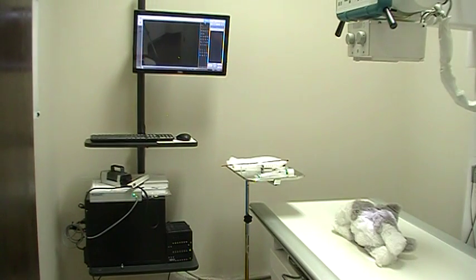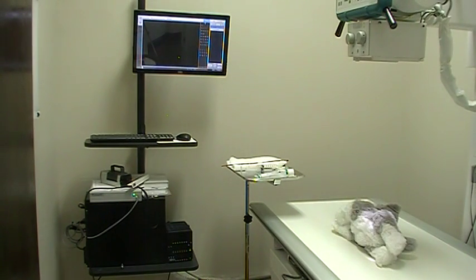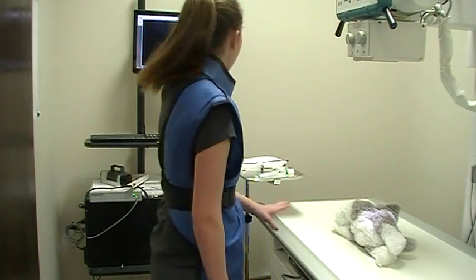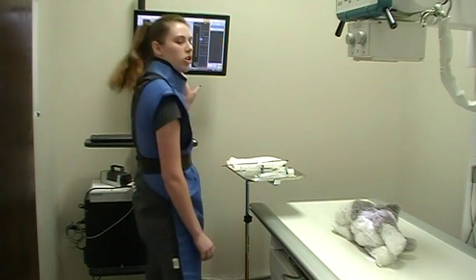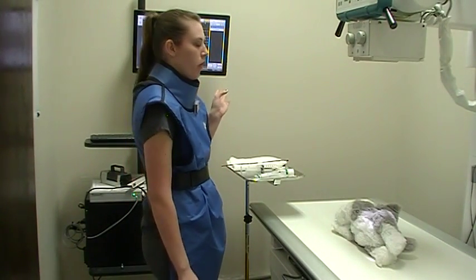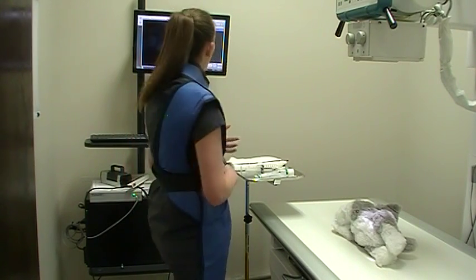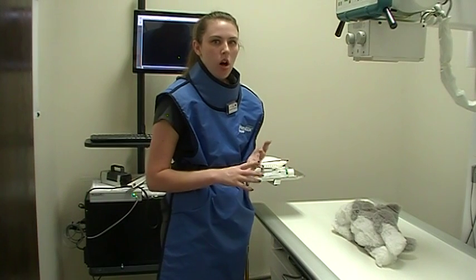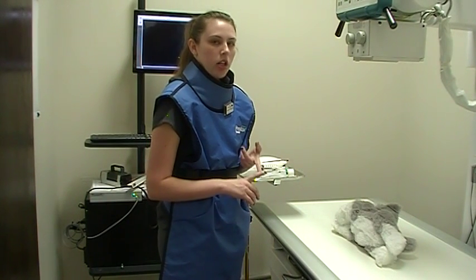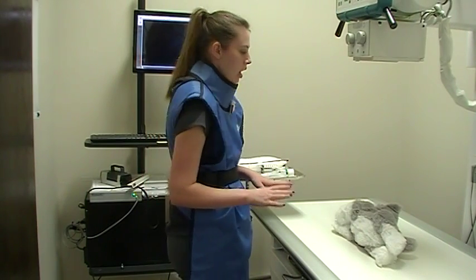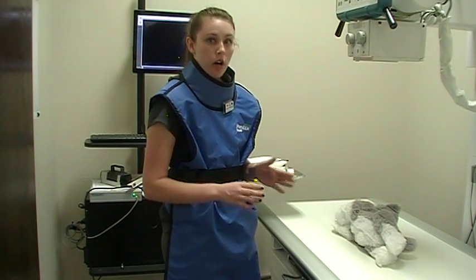I have my hand piece and I am going to go behind the wall and snap our scout radiograph. Once that is taken it is going to show up on our computer. When you look at it you just want to make sure that the collimation and your exposure factors are done properly so that you don't have to do any repeats. Once that looks good we are able to start our barium study.